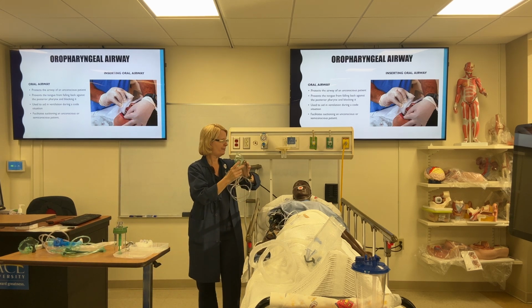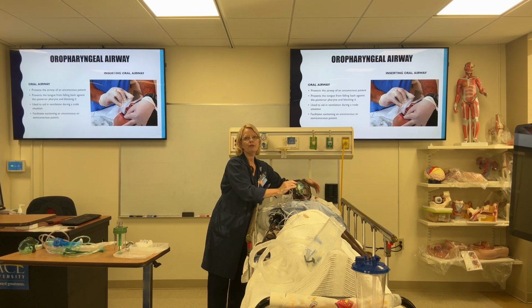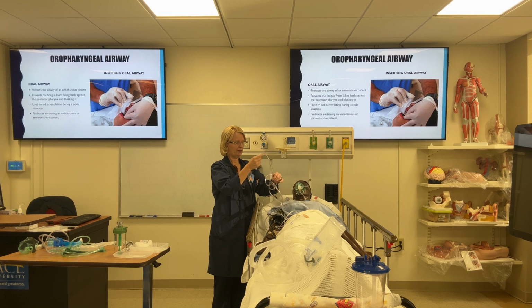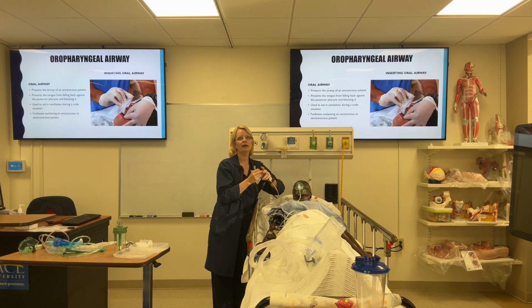We're going to put the face mask now over the patient's nose and mouth, and we're going to watch for what is going to make me happy that I'm going to see in my mask, right? So if I know the patient's chest is rising and falling, I should see steam or mist in the mask, right? That exhalation, that condensation. And I'm going to know the patient's moving their air, their airway is open, they're breathing, and the next thing I need to do is plug my oxygen into the flow meter at the wall and turn the oxygen on so the patient's getting the oxygen that they require.